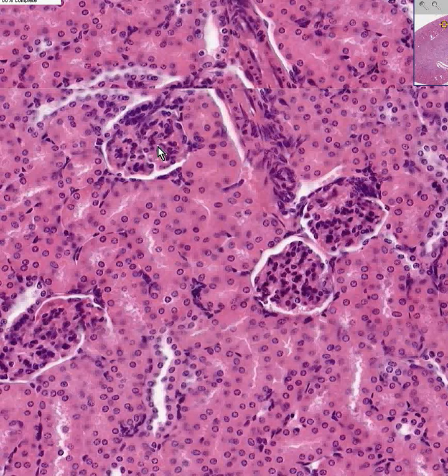They are seen all throughout the glomerulus, but they're more common towards the vascular pole. The problem is, really, in all honesty, at 20 power on an H&E stain, you often really can't differentiate between those three types of cells easily. But if you did special stains or had EM, you could see beautiful differences. Otherwise, you could say this is a distal tubule. These are proximals. Here is the urinary pole of the glomerulus.